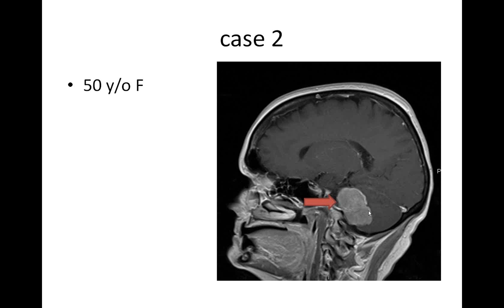And if you look very, very carefully, and it takes some training to understand this, the tumor itself is not actually arising from the brain per se. It's arising from the membranes surrounding the brain, also called the meninges. And so instead of growing out of the brain, it's actually pushing into the brain. Now that's a pretty serious thing because it's still causing, as you may imagine, a lot of symptoms. But in a case like this, 95% of the time, it's going to be a tumor called a meningioma, a tumor arising from the meninges, which tends to be a very low-grade favorable tumor.